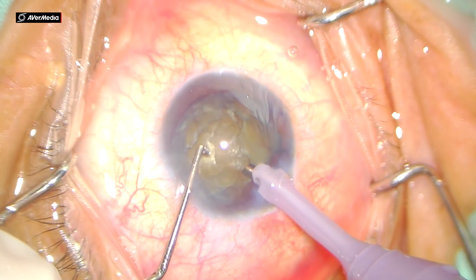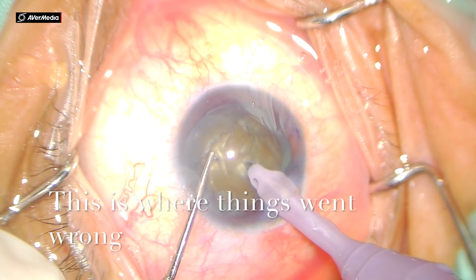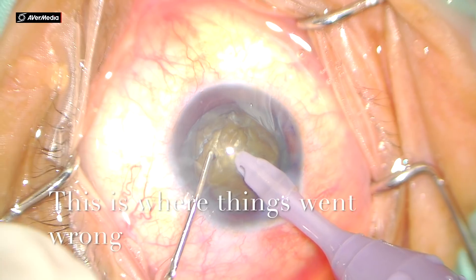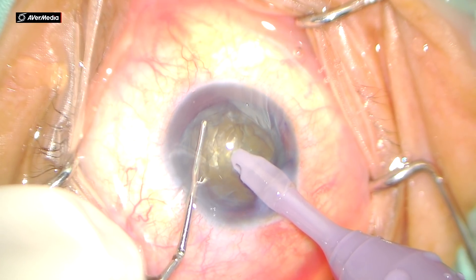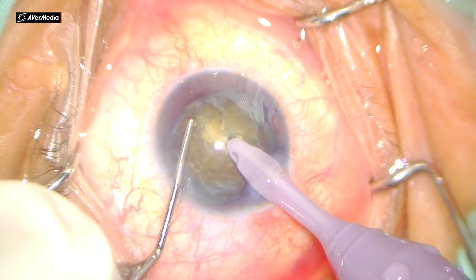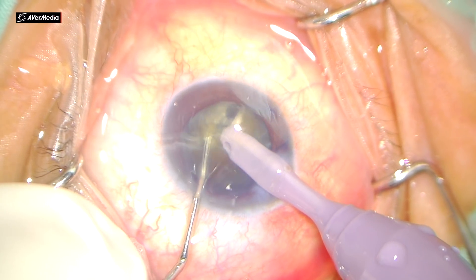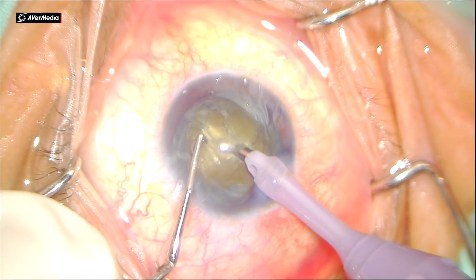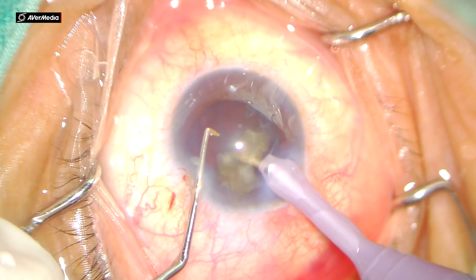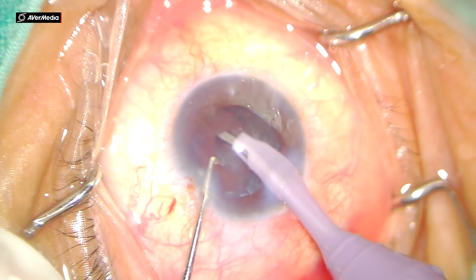I would be trying dry chop — the tip exposure is seen beautifully. I buried the whole of my tip into the nucleus, and when I tried to chop there was rotation of the nucleus with the bag itself. This is a slow motion video — again when I tried to chop there was the rotation of the bag, and probably this was the moment where I had that zonular dialysis.